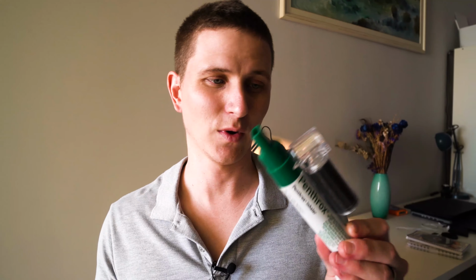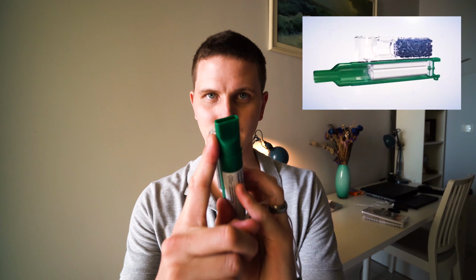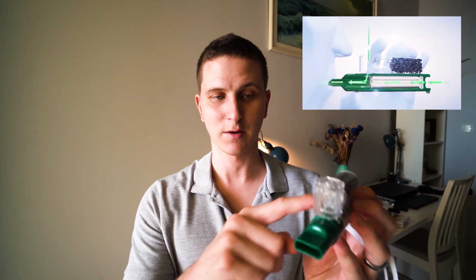What exactly is this thing? Well, how it works is that you pour the Penthrox, the actual drug, in the back of it. If you read the manual, you pop open the thing and you pour it kind of circular. You don't really have to, but you can pretty much dump it all in there. There's a one-way valve for air in the back, and inside, you won't be able to see, there's a sponge of some sort that sits inside there, and then this little canister sits on top. The patient will breathe in on the end, and air will travel through here, and through here, and go into the patient.